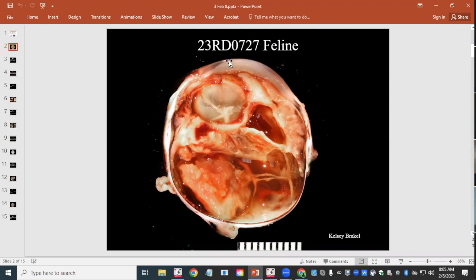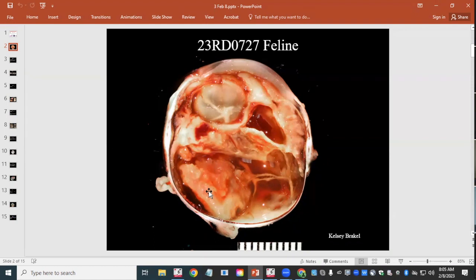We have a globe here: the cornea is up top, the optic nerve is at the bottom, and what used to be the lens is visible. The rest of the eye is filled with whitish material that has some structure to it — not just pus or exudate — but most normal internal structures have been pretty much obliterated.